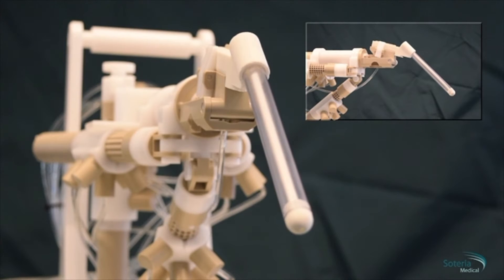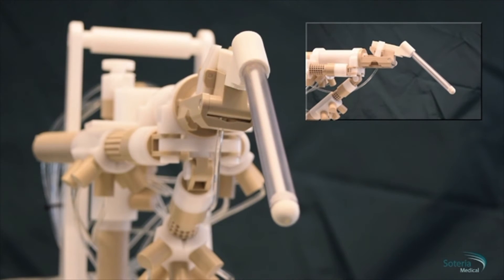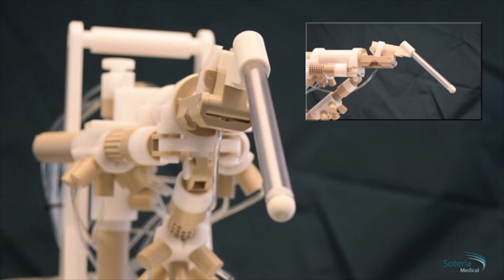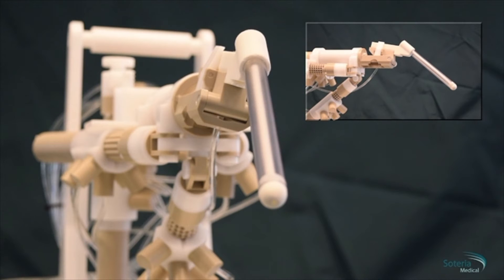This shows how the robot moves into position. Once the robot has stopped moving, a new transverse scan is carried out and dragged into position.